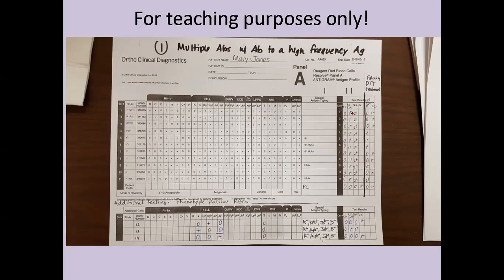So basically, what we decided to do was treat the red cells with DTT, dithiothreitol. Put on those thinking caps. Which antigen system is disrupted by sulfhydryl reagents such as DTT? The answer is KEL. And what do we know about some of these KEL antigens like little k, KPB, JSB? Are you looking at this panel? Do you see how all three of these antigens are present on every single panel cell?